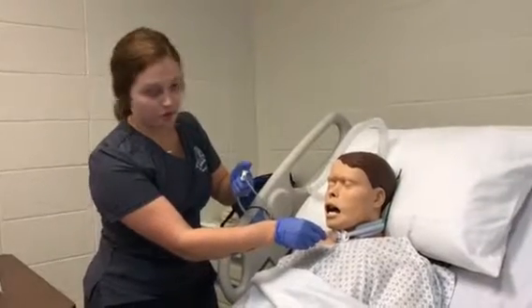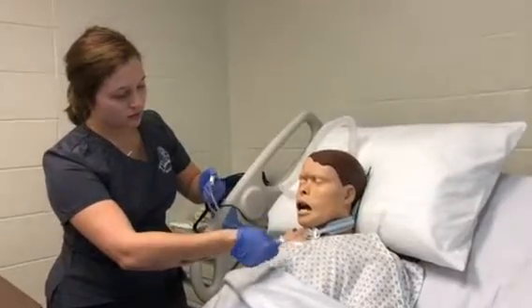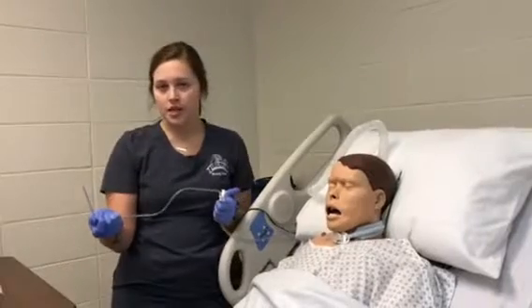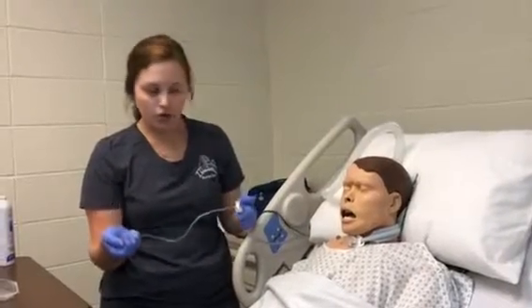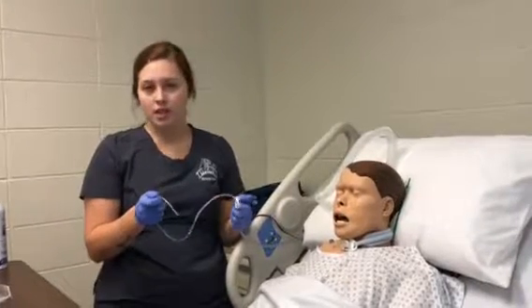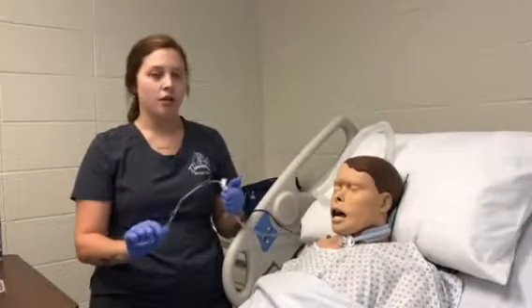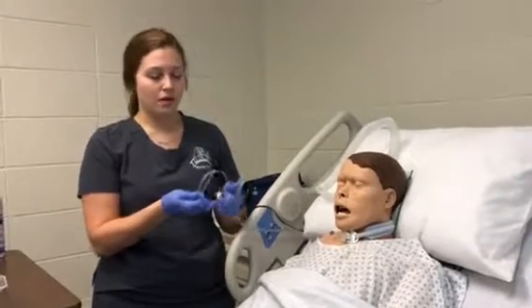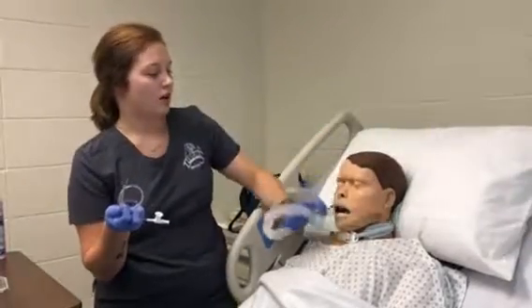Okay, and now when we suction out, we're going to intermittently suction and twist. And that should take 15 seconds or less by the time you go in and you come out. He didn't get a whole lot out, so we're done with suctioning at this point. If you need to suction more, that just depends on the amount of drainage you get out and the appearance of your patient. We're done with this. I'm going to go ahead and remove this and put it in the trash and put the oxygen back on my patient.